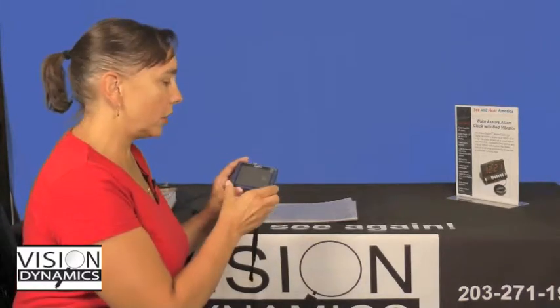You've purchased it, and we're going to go over how to use it and some of the ways you can apply it in your life. So when you take it out of the box, it may have a little bit of battery life, but you're going to want to go ahead and plug it right in and get it charging.